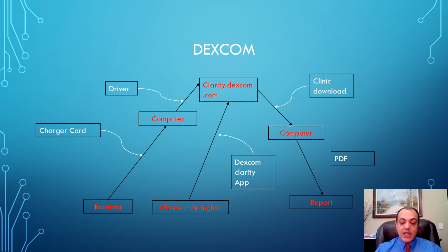The app that is used to check the blood sugar is called Dexcom G6, but the one that you use in order to share the report is the Dexcom Clarity. And that is why a lot of people get mixed up in that step, because they have the app that is used to see the result, but they don't have the Clarity app, which is used to share it, and therefore they are unable to share the results with their doctor.